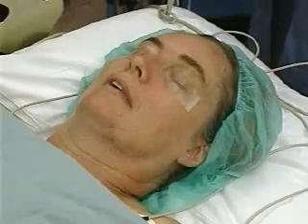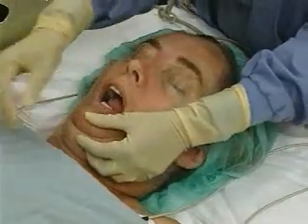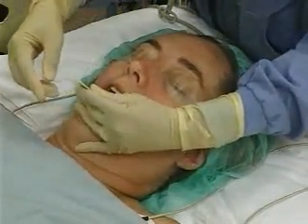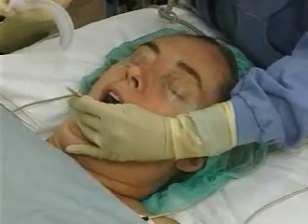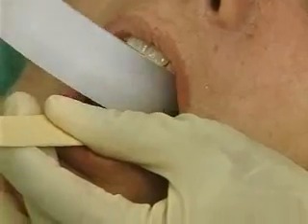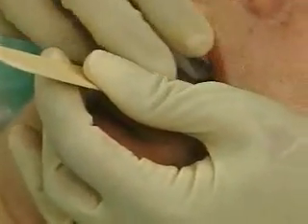Patient positioning should be supine or lateral. Open the patient's mouth, place the tongue blade at the base of the tongue, and draw the tongue anteriorly to lift it off the pharynx. Place the airway in the mouth with the concave side facing down so that the distal end is approximating but not touching the posterior wall of the oral pharynx.